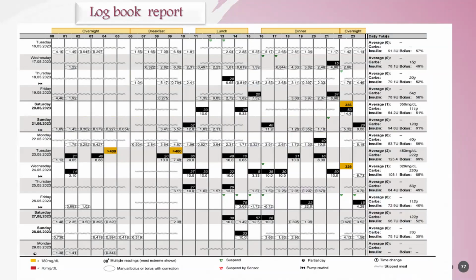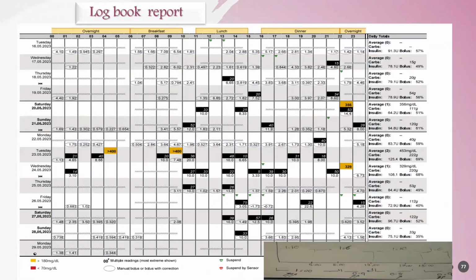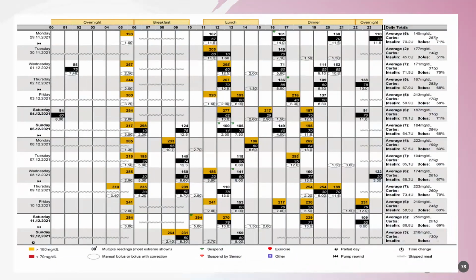Okay. We face a lot of issues regarding this. Another patient is high at 5 a.m. all the time. That means he skips meals, or that the previous basal is not good. Okay. From each entry, we take a lot of time to see these tiny numbers.